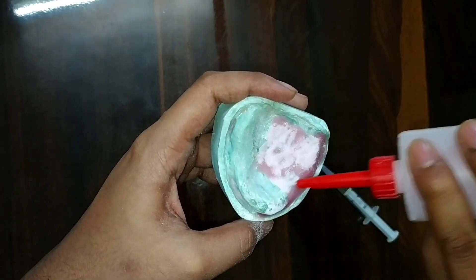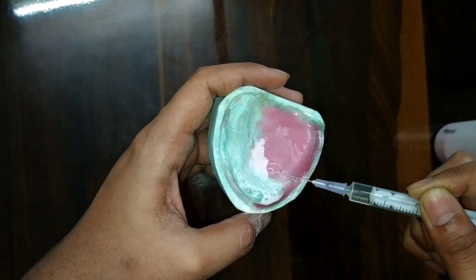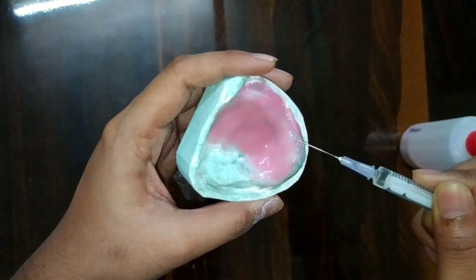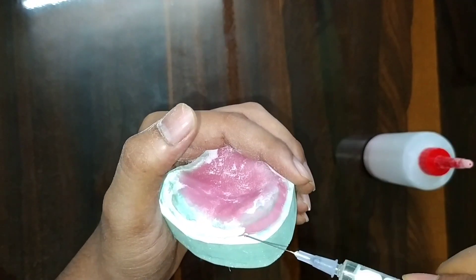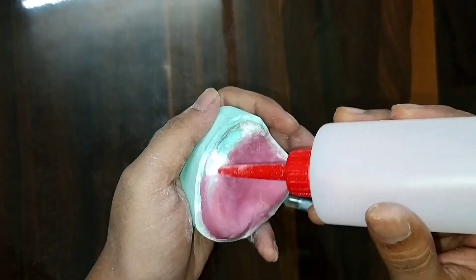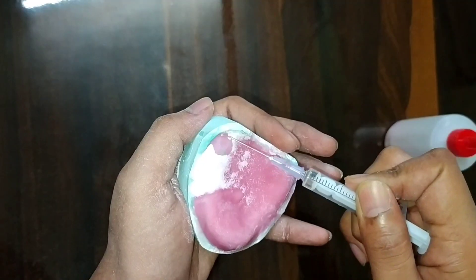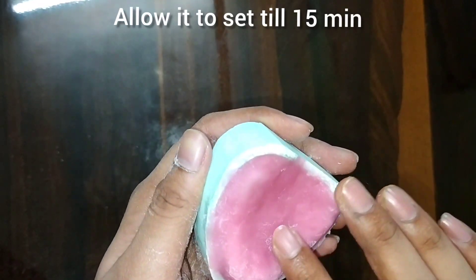A slightly thick layer of 1 to 1.5 mm should be formed. Our denture base is almost ready — allow it to set for 15 minutes.